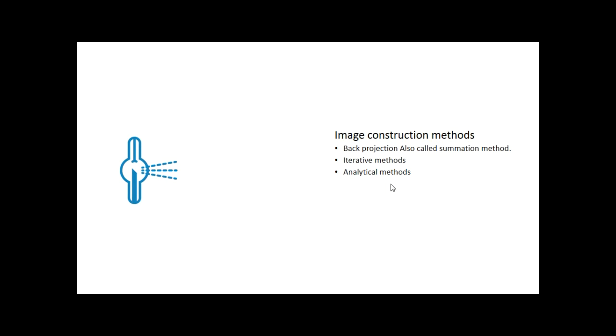Just imagine, to simplify things, we have a CT X-ray tube and we have a matrix, an object which has 4 pixels only. When you expose, you get an exposure value at the end of the detector. It could be 5 and 7 or any number.